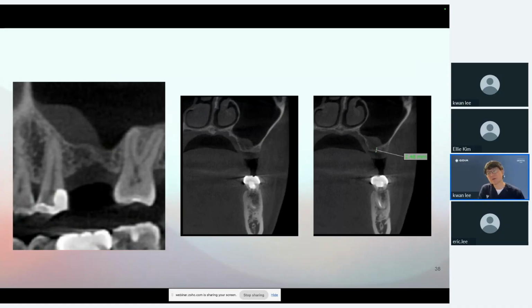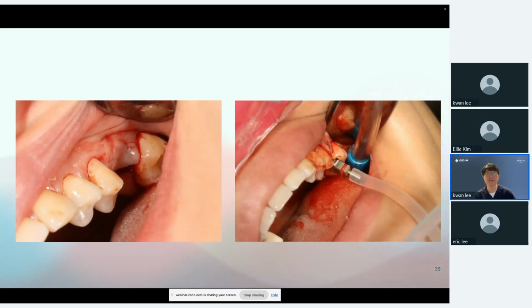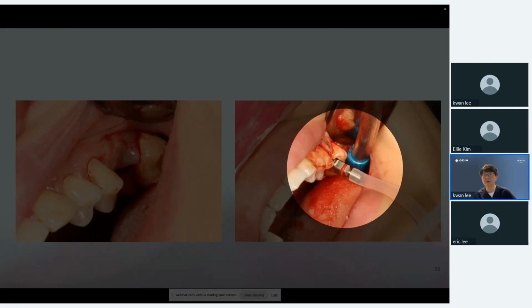Whenever you have a crestal residual bone height of 2, for most of the crestal sinus augmentations, I do the lateral, because the amount of elevation is so much that the lateral sinus would be more predictable. That's true. But now, once I use these techniques, closed chamber sinus elevations, I do crestal incisions, full thickness reflection, and create a closed sealed chamber.